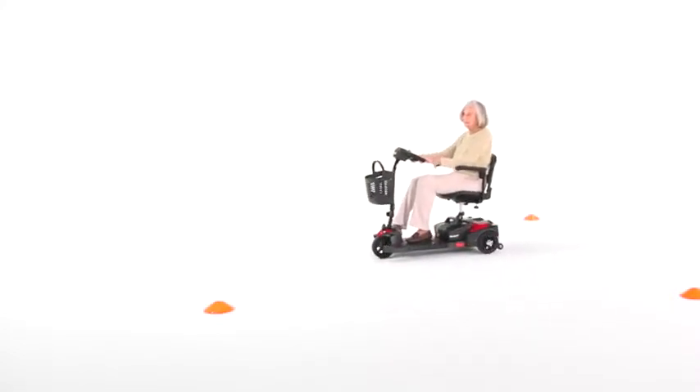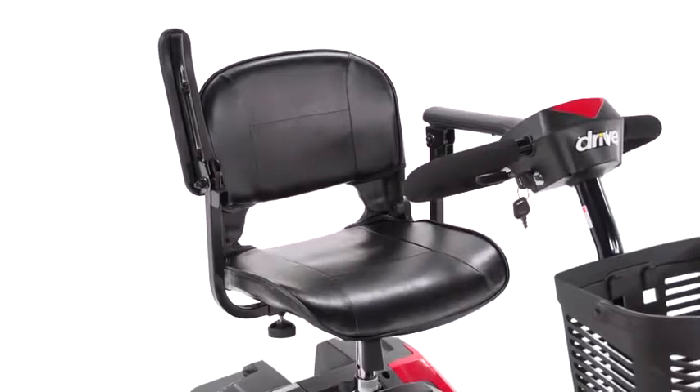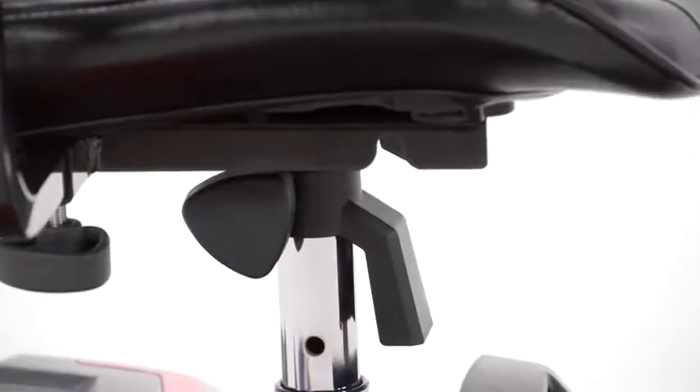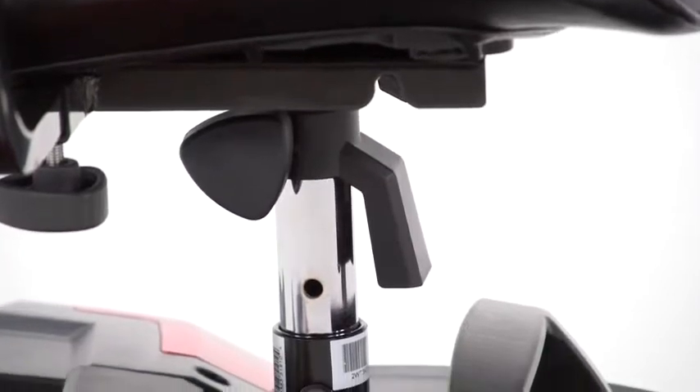Along with great performance, the Spitfire Scout offers excellent comfort. The upholstered stadium-style seat can swivel 180 degrees and also has three height selections to suit users of nearly any height.